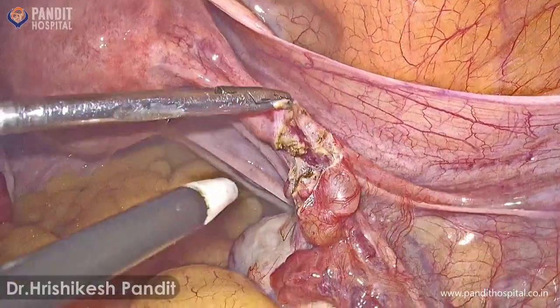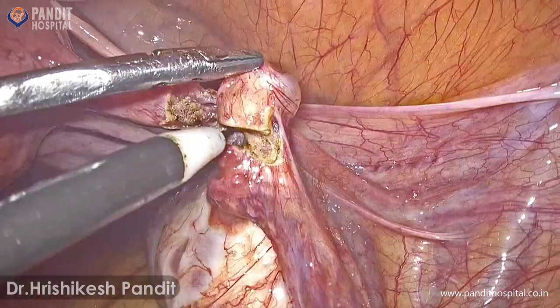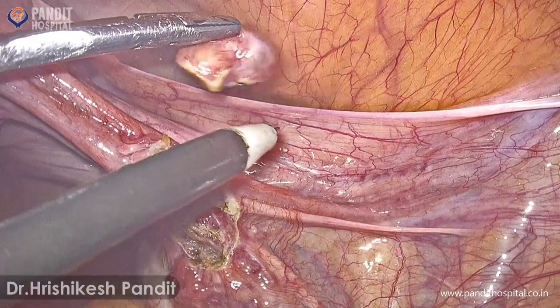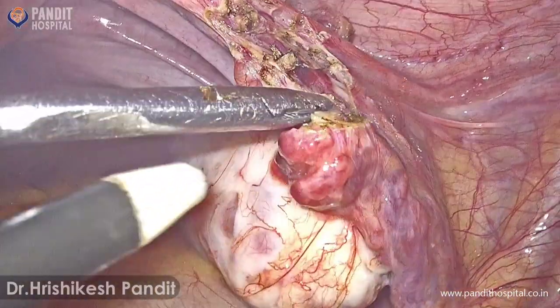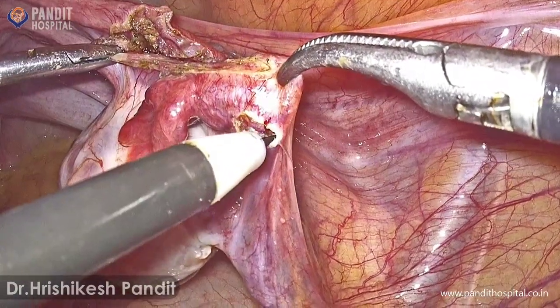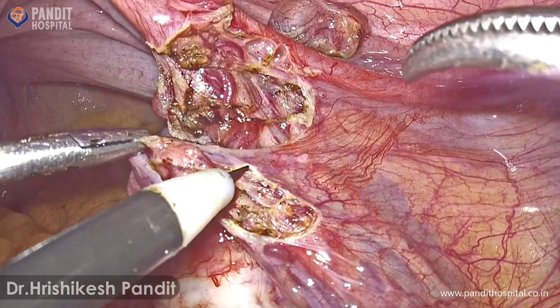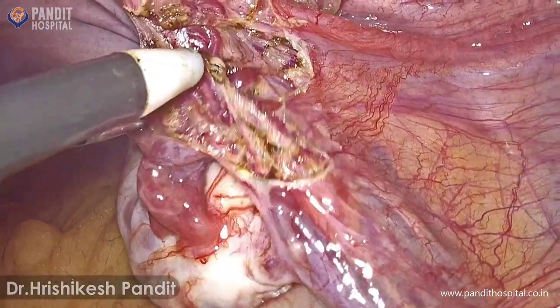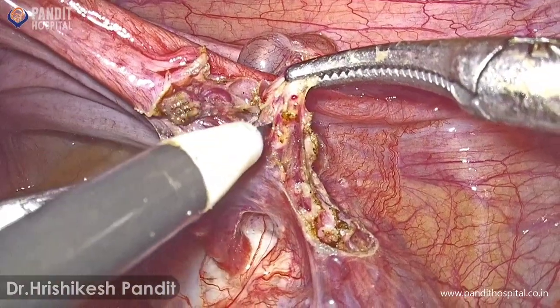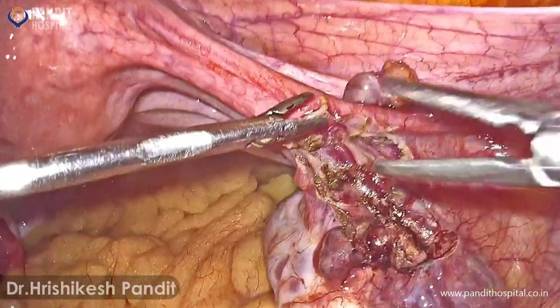You can observe that the distal portion is really small with a small cyst over it. First, I am trying to do the anatomical correction of the distal portion. I am going to use the PCOD drilling needle with monopolar cutting current. The proximal end of the fimbrial portion has rotated and come laterally, so I am using a small cutting current for releasing that band and making it straight.